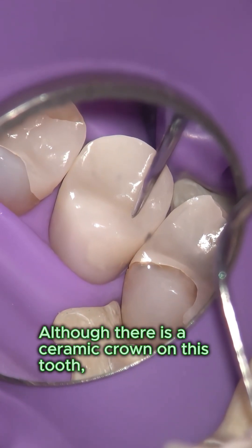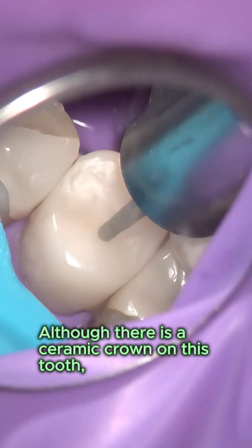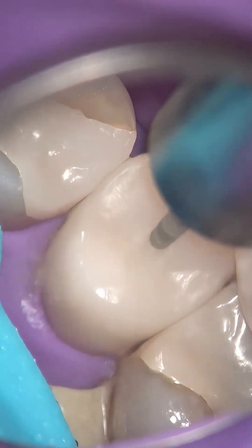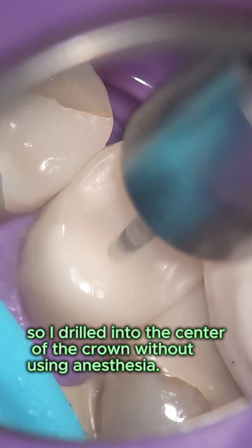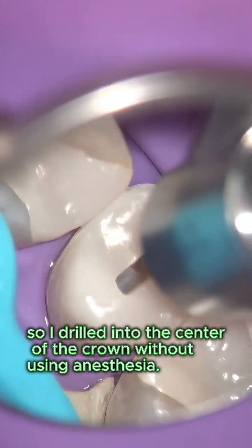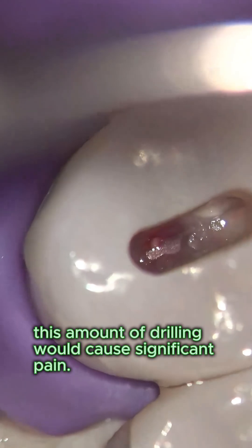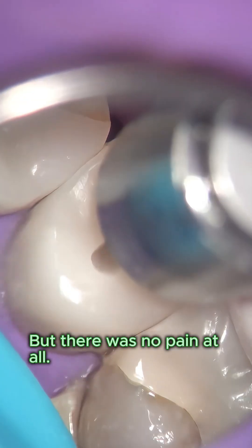Suspecting the pulp was non-vital, I drilled into the center of the crown without using anesthesia. If the pulp were still vital, this amount of drilling would cause significant pain — but there was no pain at all.